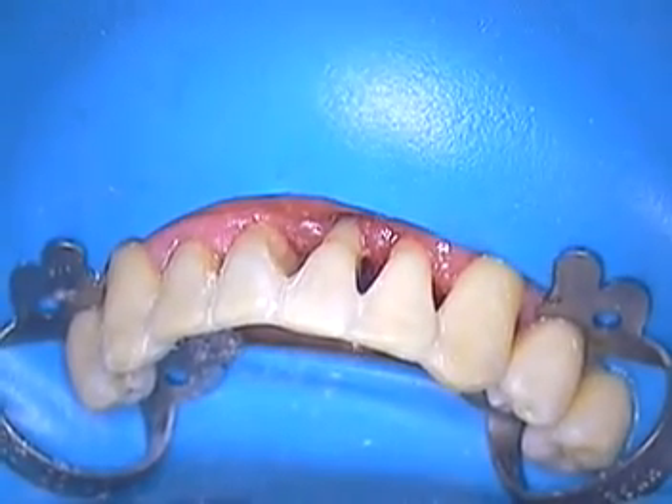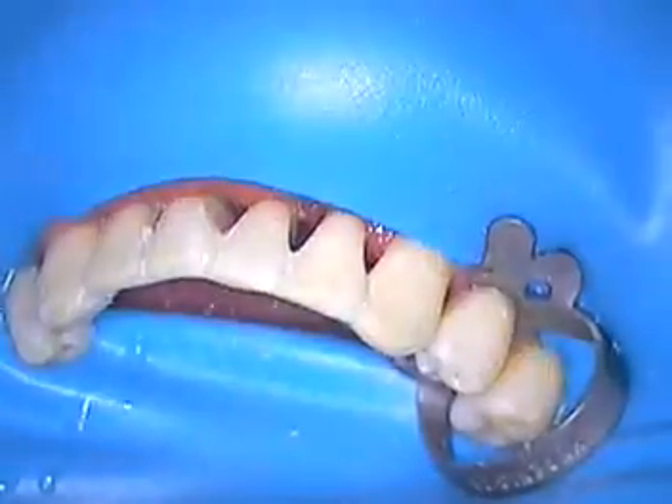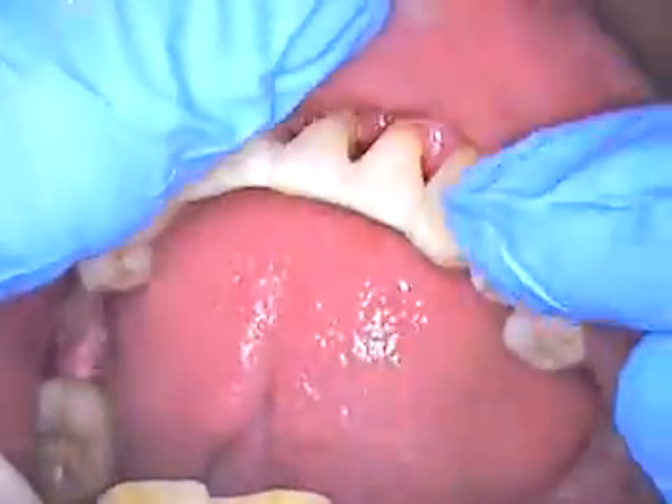Now we're going to adjust the bite, so I'm going to take the clamp off and the rubber dam off. Everything's going to go left here. Clamp first. And we'll just take a quick look around, make sure everything's okay.